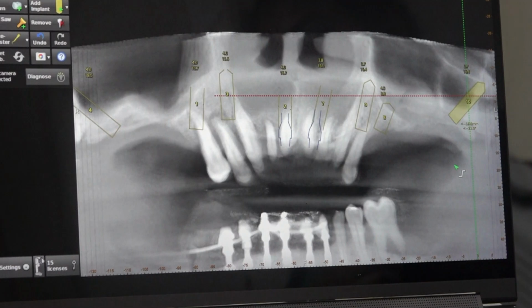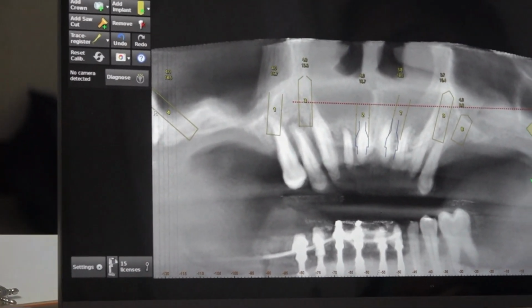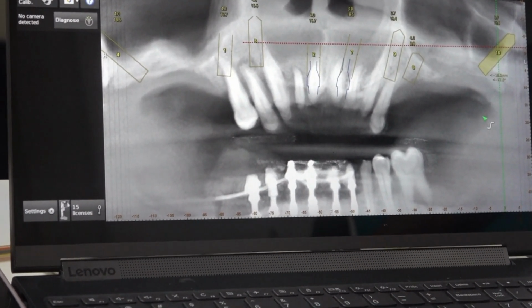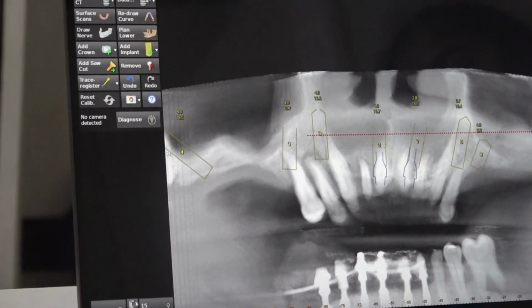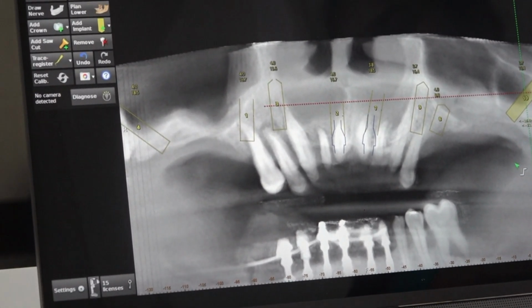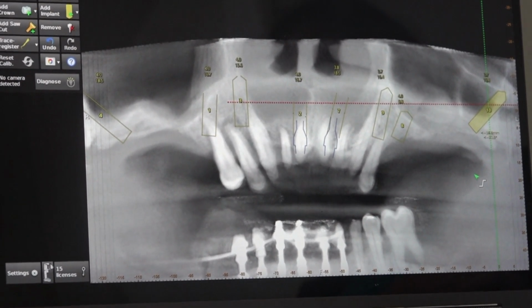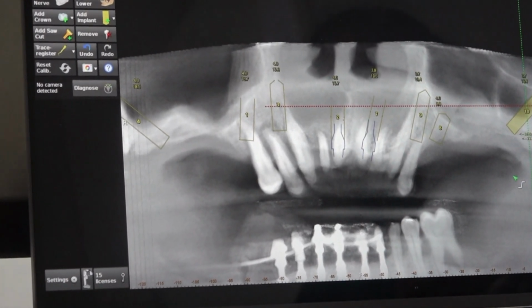Okay, and another problem if you do pterygoid in this patient with single piece is that the pterygoid angulation will be more, around 45 degrees. The abutment will come angulated, not straight, so you will have prosthetic challenges, insertion, all difficulties. So one option is we can go for pterygoid with screw retained, single piece multi-unit. Or if you are going for cement retained, you have to go for a metal frame and metal acrylic or whatever it is. Or with single piece multi-unit you can avoid pterygoid also. You can give a cantilever. That is the advantage of single piece multi-unit. You can give a cantilever, which is not there in single piece cement retained, because of the difference in biomechanics. Okay, finish.